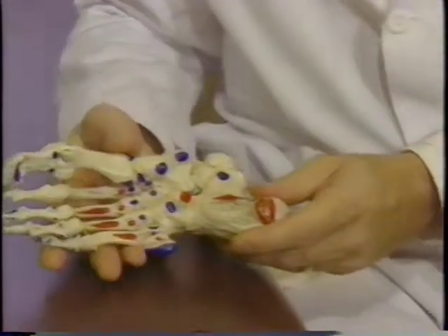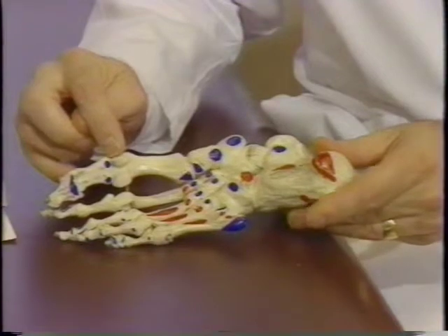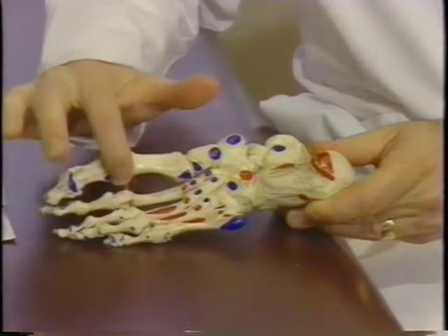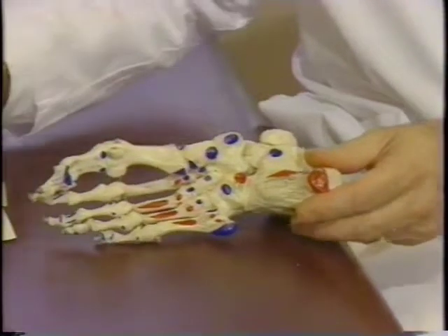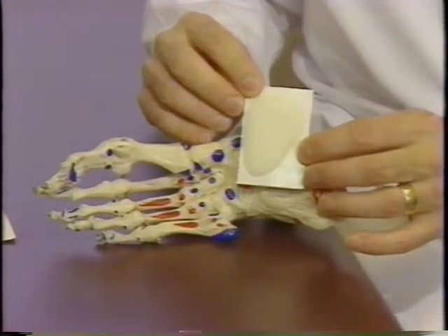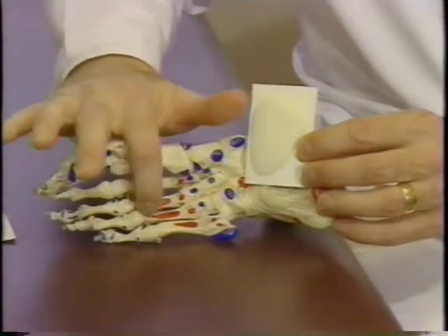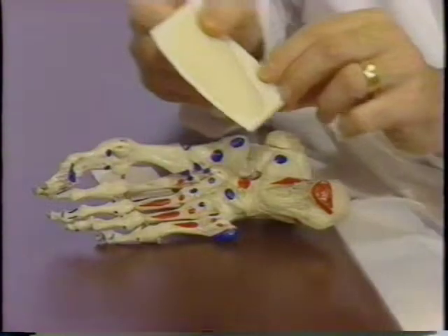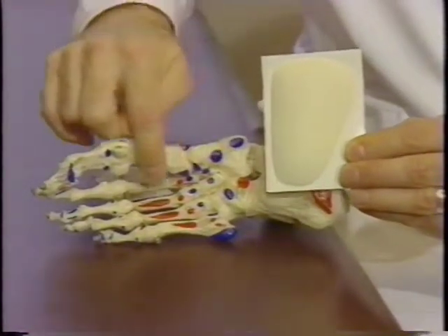If we look at the bottom of the foot, the two areas of importance with the placement of the HAPAD are the metatarsal heads and the arch of the foot. The two different pads we use most frequently are the metatarsal pad, which will be placed just proximal to the metatarsal heads, and the longitudinal arch pad, which is placed in the arch of the foot.